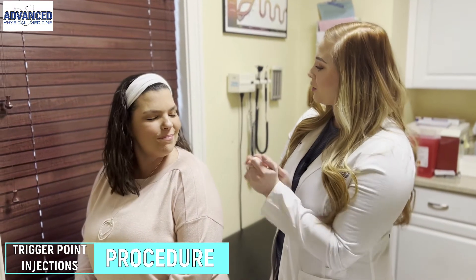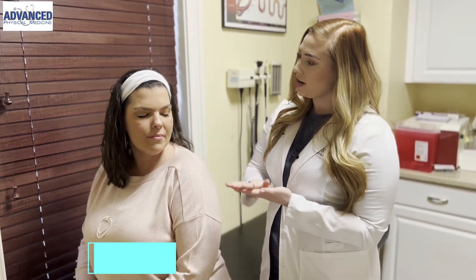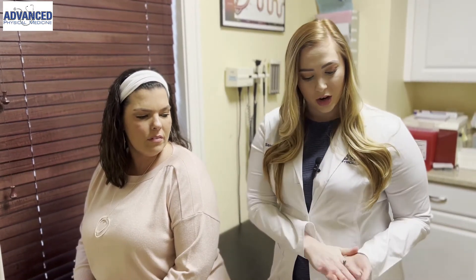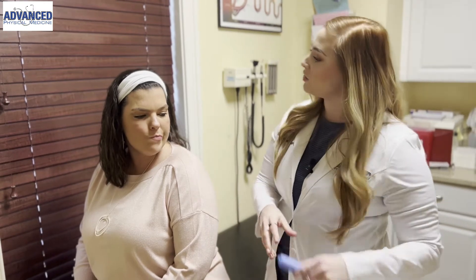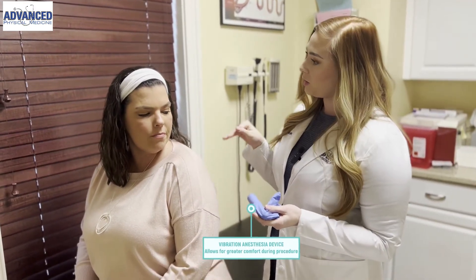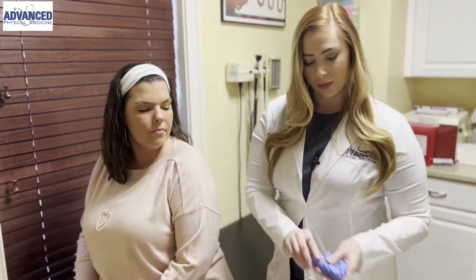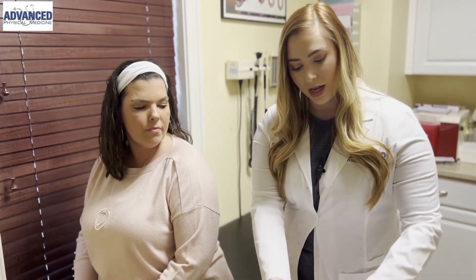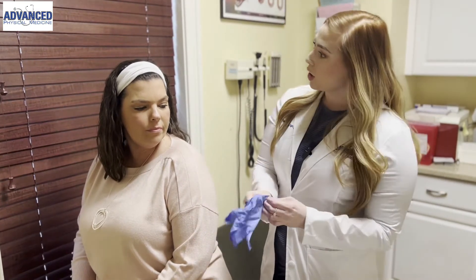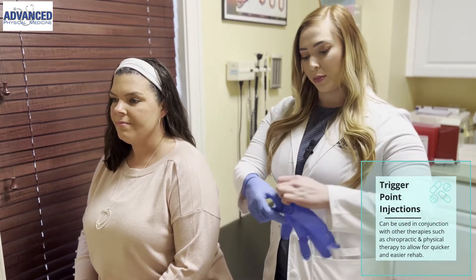Hi Amy. We're going to go ahead and perform your trigger point injections today in the trap area here. I have all my equipment here already ready to go. We're going to be using this vibrating anesthetic device today — this tricks the nerve pathways, confuses the nerves, and makes the injections more comfortable. Let me go ahead and get gloved up. First, we're going to be marking your area and I'll feel around on you, finding the trigger points.